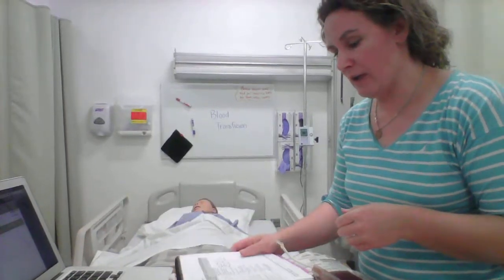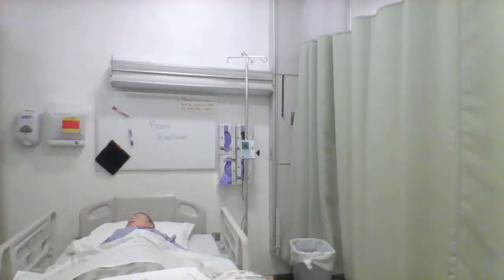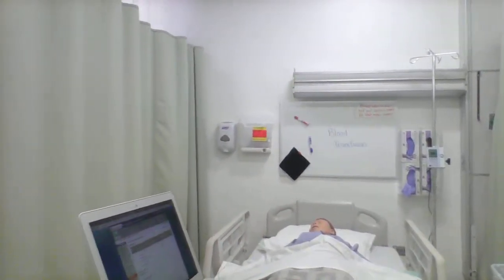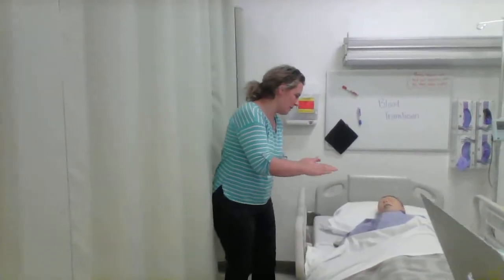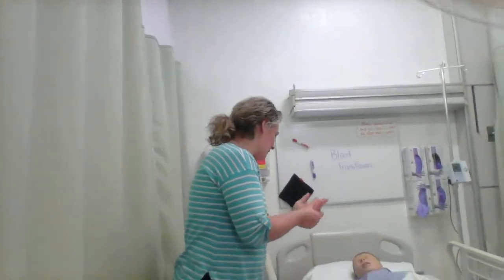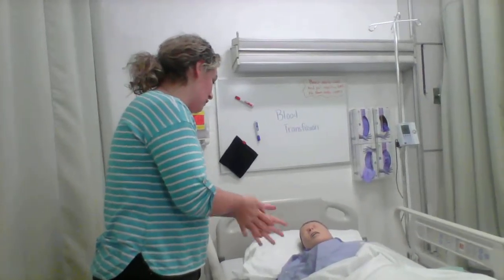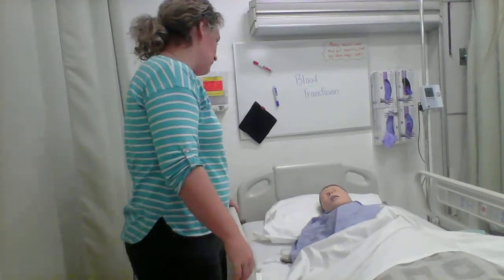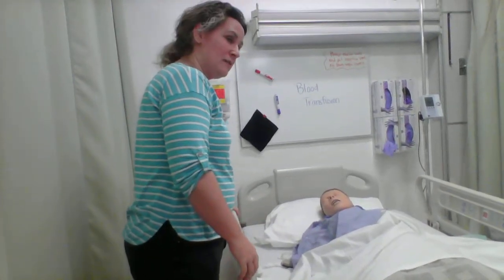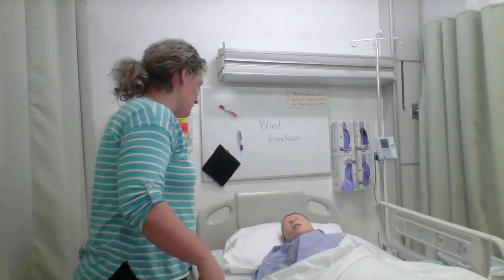Okay, so we're gonna go ahead and walk in, knock, and I'm gonna come over. I'm gonna perform hand hygiene. Hi, Mr. Crowley. I'm Lee Short. I'm gonna be your nurse today. I understand that you had some surgery, and that your hematocrit and your hemoglobin values are low, and you need some red blood cells. So we're going to go ahead and give you a blood transfusion. Are you still okay with that?